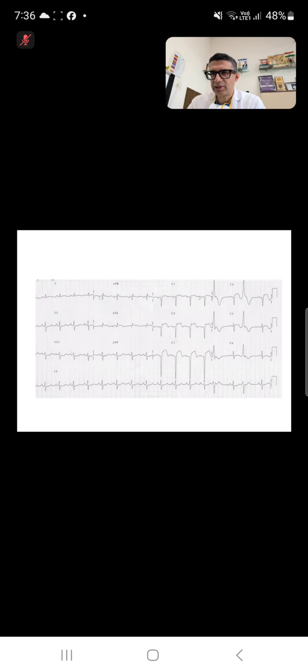As sir mentioned previously, the reciprocal changes were considered to be benign. That means it doesn't matter whether the patient has reciprocal changes or not. But now we know that when you have reciprocal changes, one, it could be just because of the normal phenomenon of the current. Two, it can occur because there is ischemia at a distance.